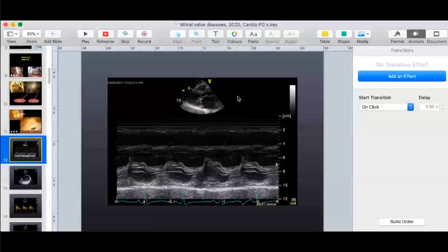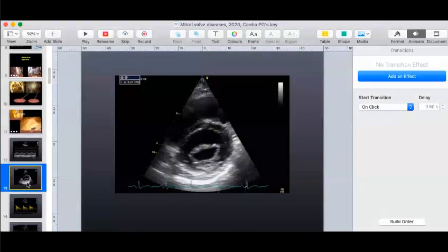Now, let me go to the next image. Now, this is fairly obvious, fairly simple, nothing great about it. But again, the questioning will be directed towards you as to how would you approach this patient and try to get a good mitral stenosis orifice. So what would be your approach? You're doing an echo, and how would you go about getting this particular image? So going to the papillary muscle level and then coming back to the mitral leaflet and measuring at the tip of the mitral leaflet will be ideal. Okay, so that is correct.